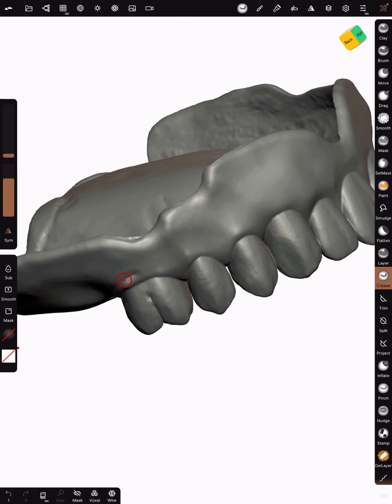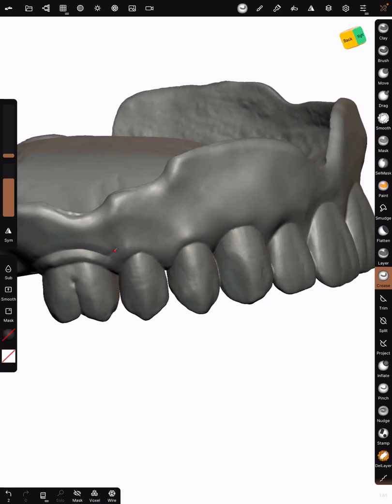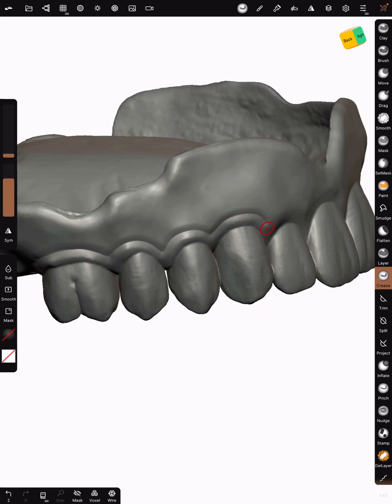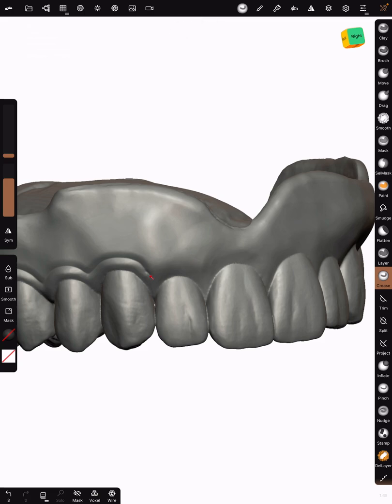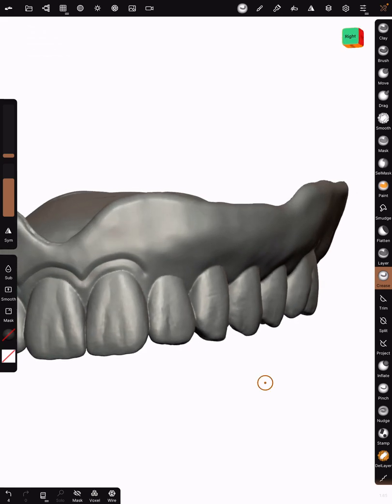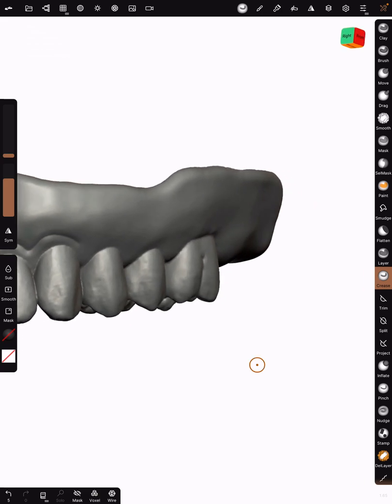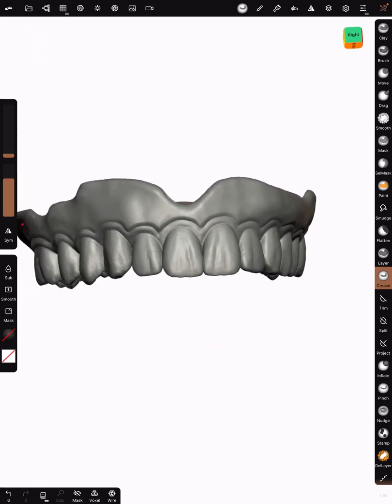Right now I'm at 20 for the crease. Make sure that symmetrical is off. What we're going to do is just come along with that crease and create some rolled gingiva. Use your fingers to rotate the model and your stylus to use the tool. My intensity is pretty high up because I'm creating some gnarly rolled gingiva here.